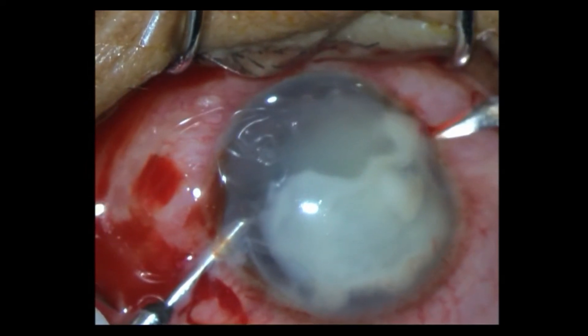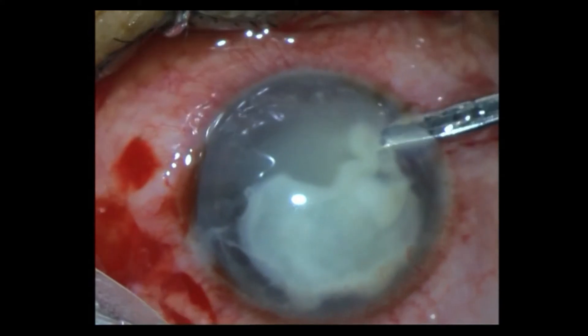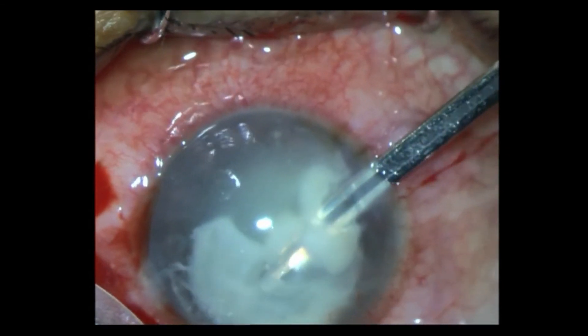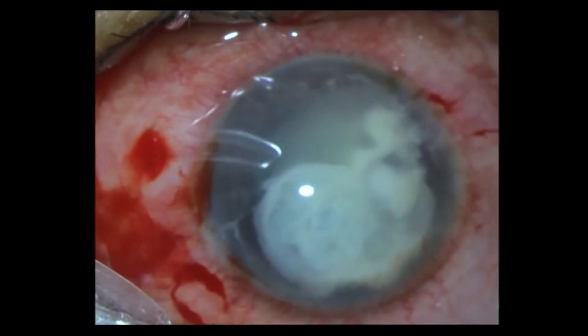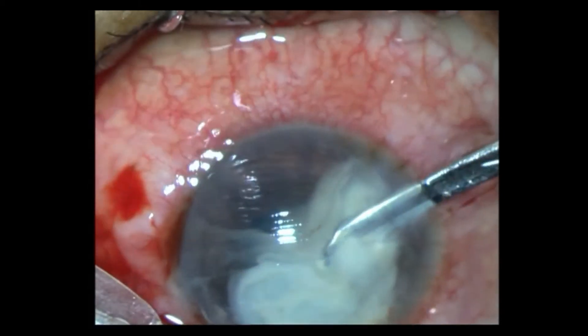So I increase the paracentesis and again try to depress and bring it over. Finally I give up and go in with a Simcoe cannula — I thought I could aspirate it, or engage it and pull it out. The other thing that I am trying to do is separate all the attachments. See how fibrous it is — it's a sheet, actually a dense sheet that has formed.